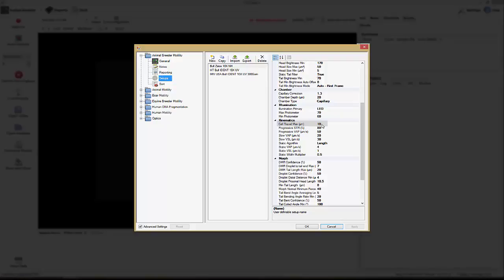This number should not be adjusted. You should keep it at 10. It will standardize your analysis. This is only adjusted in extreme cases of extreme motility to keep the tracks connected. It is a rare animal event. It is not applicable to being adjusted in human clinical applications, and you should leave that standardized.